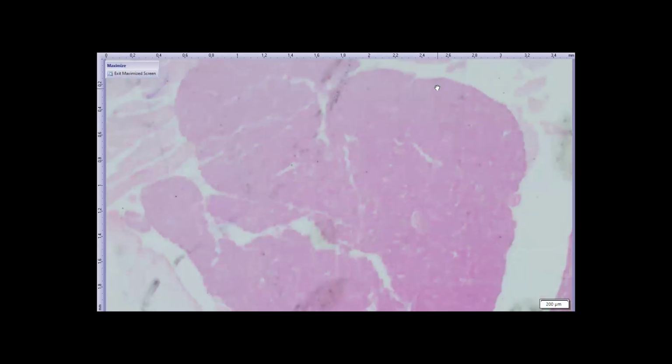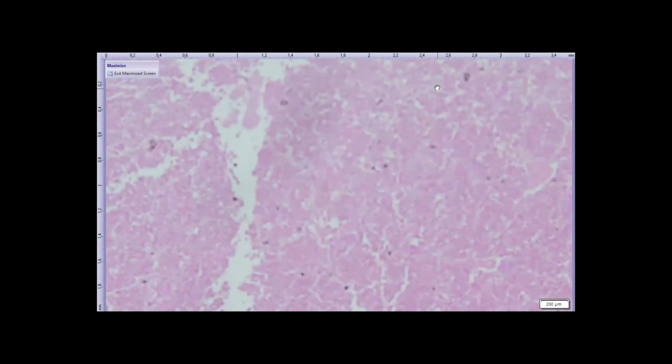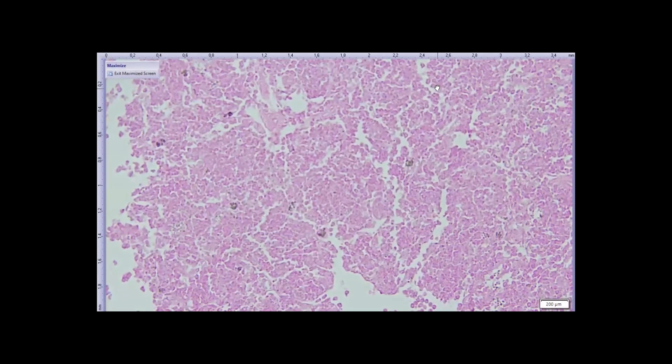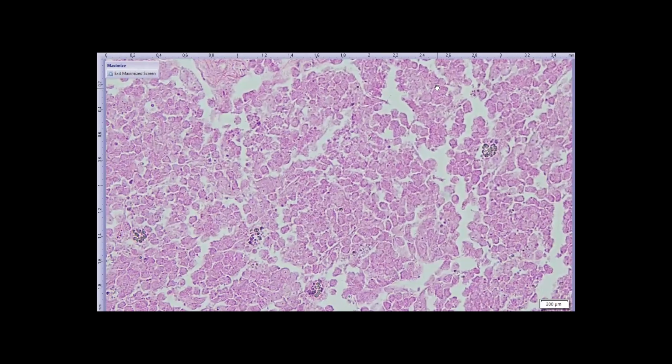There's another structure you may have noticed within that choroid, and that's this structure. You'll find it in all three, the octopus, the squid, and the cuttlefish. And it's called the white body. If you see it in the gross eye, you might be convinced it's white in appearance. And this structure, if you go to high magnification, you might guess at its function. It's made up entirely of round cells, and this is a hematopoietic organ.